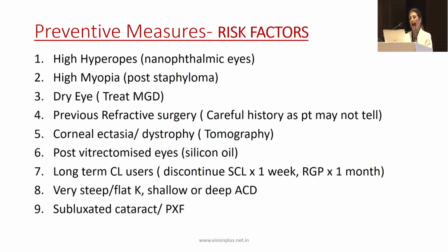So those are the high hyperopic patients, high myopic patients. You have to be much more careful about your biometry. Repeat it, as was said by my previous speaker. Call them on another day. And do tell them also that these machines are only estimating it. They're not 100% calculating. There's always a little spherical deviation in your measurements.